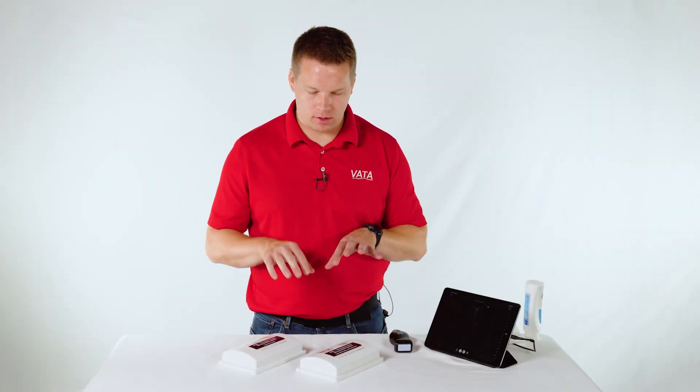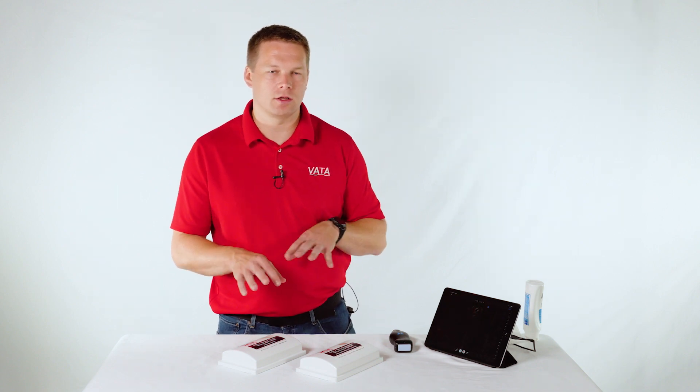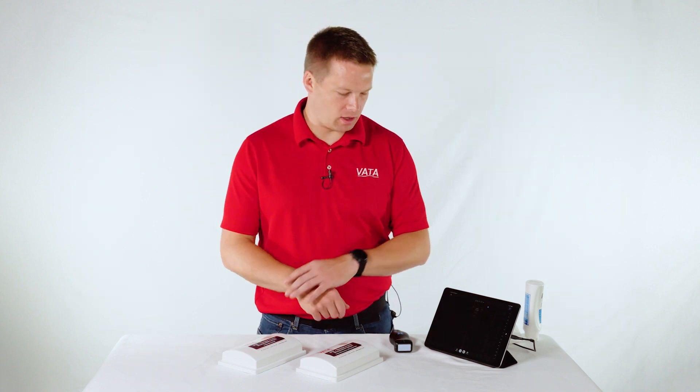Hi, I'm Andrew with VATA and today I want to go over a couple of our ultrasound models. I want to focus on showing you two different models, the differences between them, the vein configuration in each one, how they can be used, how some of our customers use them, and then I'll answer some of the frequently asked questions we get about the models, including care, longevity, and things like that.